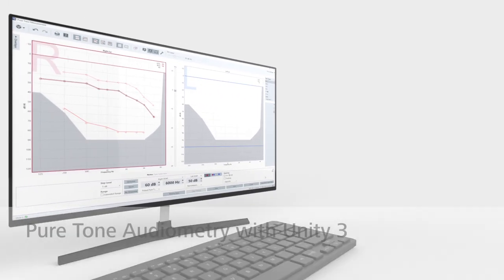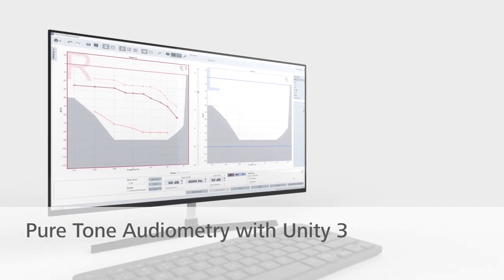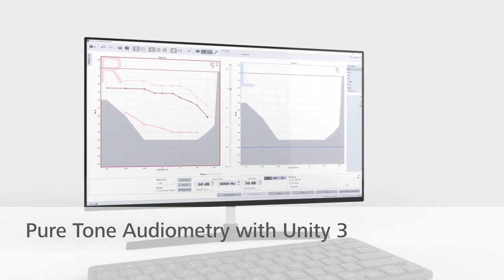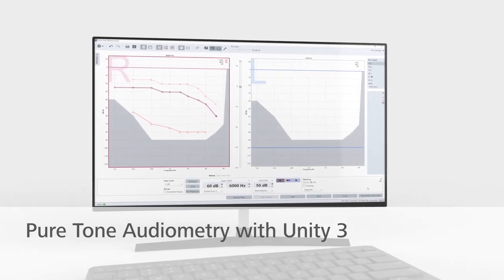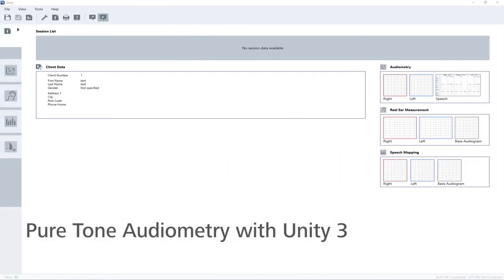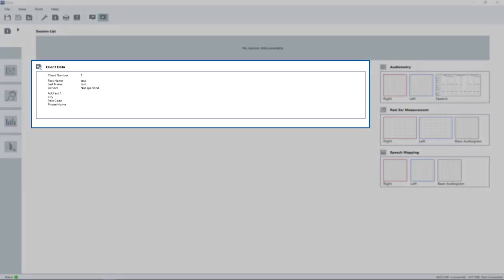This video shows how to make a pure tone measurement with the Unity 3 audiometer. After opening the Unity software, you find the general information of the selected client on the central dashboard.